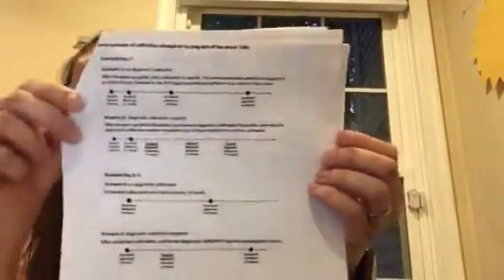Okay, it's funny because I actually don't get the calibrate now alert often on the 12 hours. That's the one that I get quite often in between there. I have my alert set an hour before calibration is going to be needed, so I don't usually get that one. But that's at 12 hours.